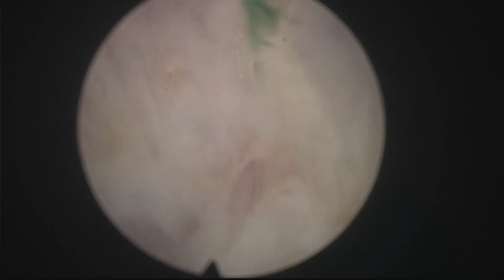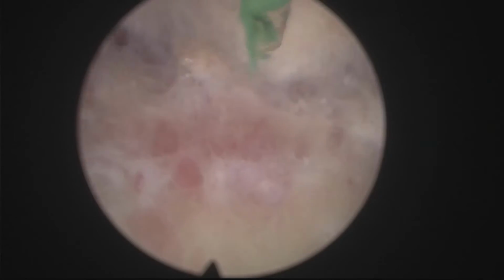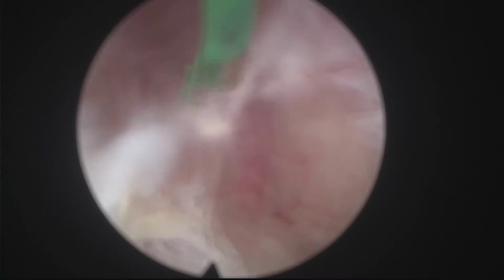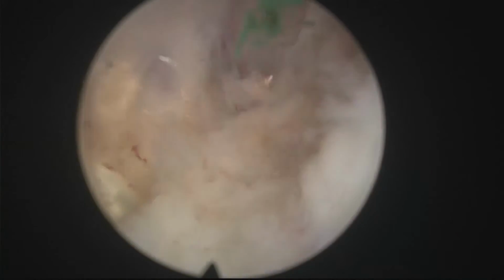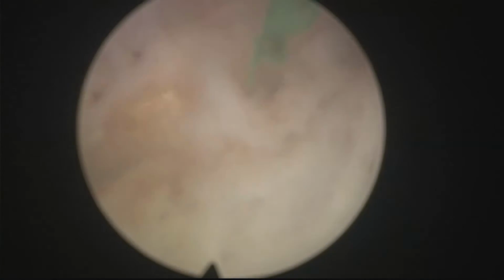it is important when you do MoLEP to progress and to be able to detect very early if you're going too deep in your dissection, especially when the plane is altered, like here, due to this previous inflammation. Sometimes, in these cases, you can dig a little bit deep in the peripheral zone posteriorly, so you have to be careful and progress. And if you detect that you're going too deep, then correct before it's too late.